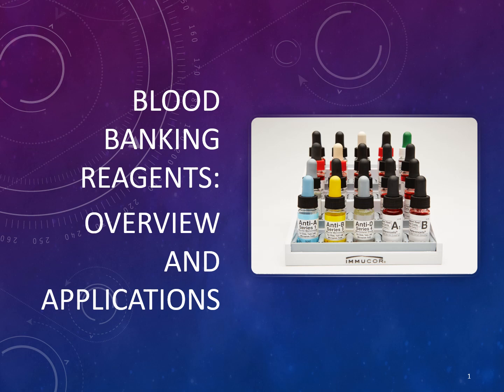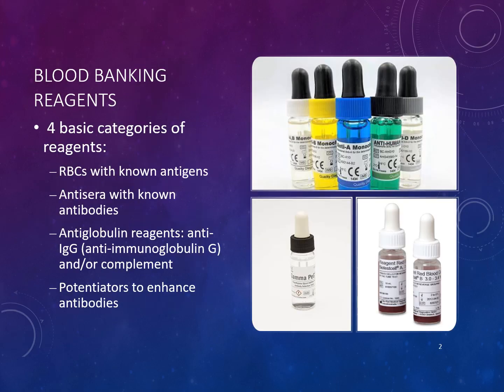In this lecture, we will cover the blood bank reagents that are used for testing within the blood bank department. In order to help you comprehend the reagents, you must first understand that blood bank is basically all antigen and antibody reactions. And in these cases, you have a known, which is your reagent, and you're looking for the unknown, which is whatever is in your patient sample.